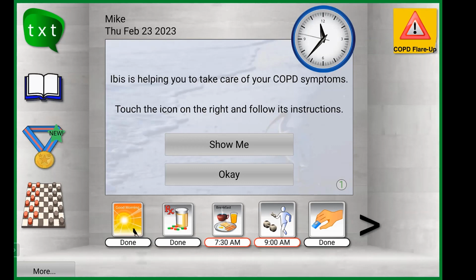You might say, hey, I just flipped the numbers, leave me alone. And that's all that we need to talk about. Or you might say, hey, I'm really, really worried. What should I do here to make sure that I get the care that I need and the right care by the right person at the right time. So our team is here on standby for all of these various deviations in health data that you might report through the device. That could be your pain, your mood, your shortness of breath, swelling in your legs, that you wake up and you might be wondering, should I take an extra diuretic or not? All of those are just standard conversations that we have with our members on a daily basis.